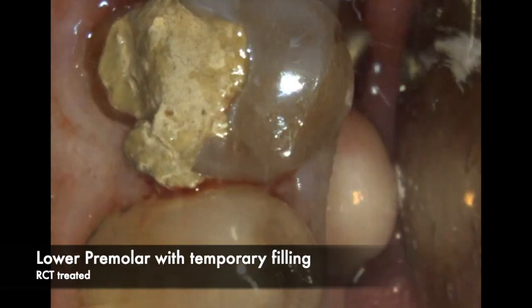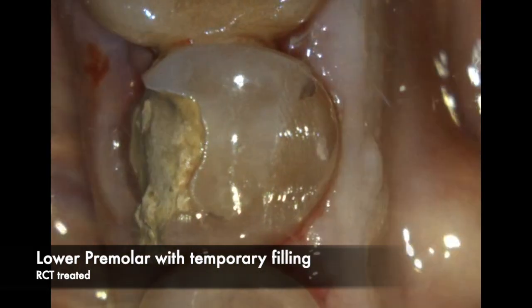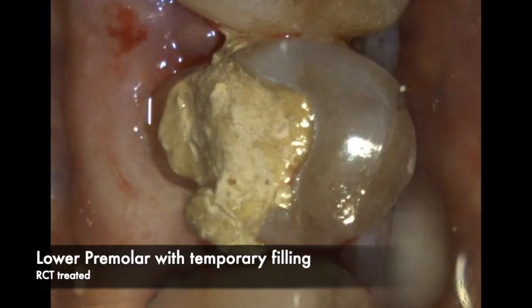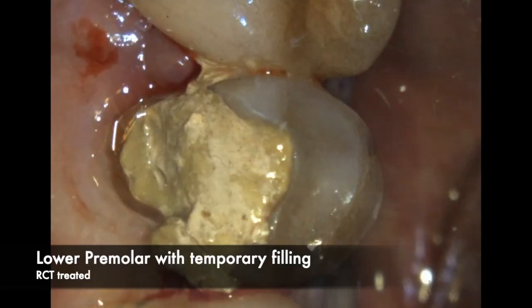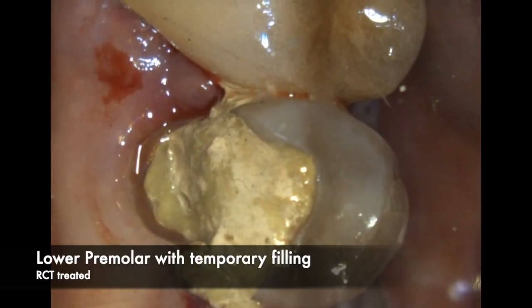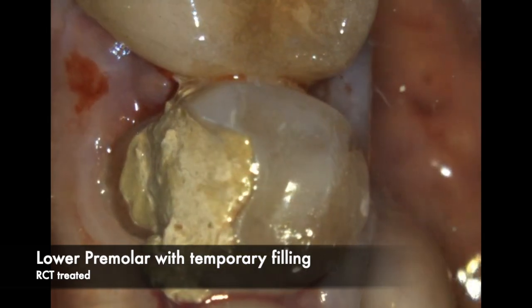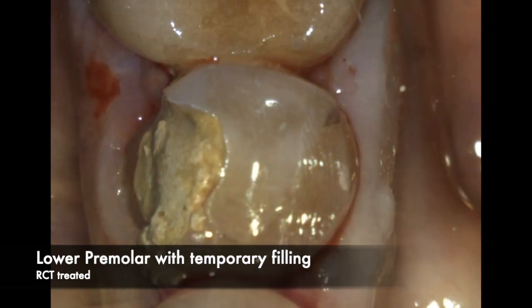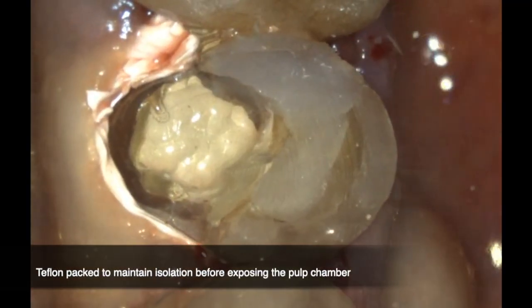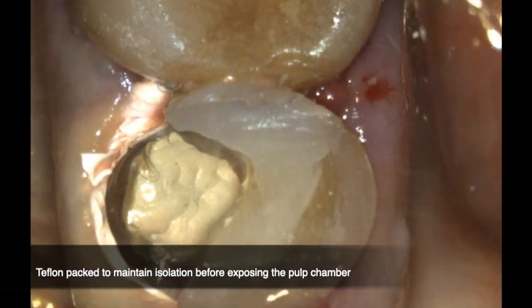As you can see, this is how the patient presented after the root canal was completed by the endodontist. The buccal cusp was completely fractured, there is a distal-occlusal older restoration in there, and after the root canal was completed the endodontist placed some temporary cement around that buccal cusp.